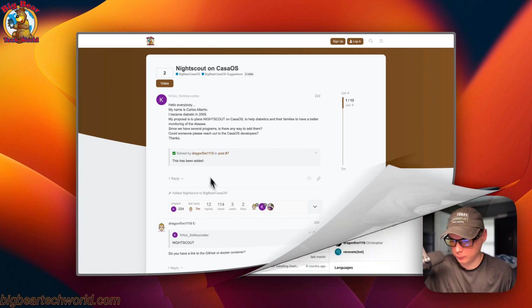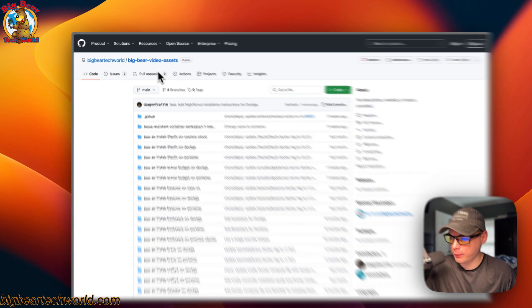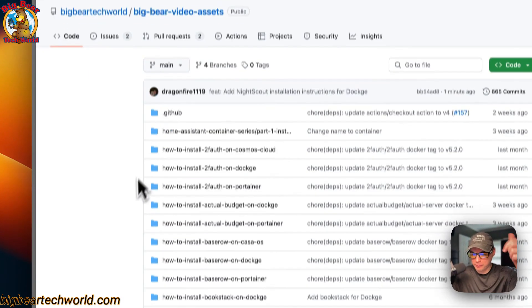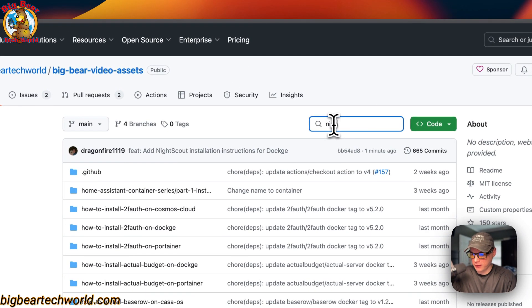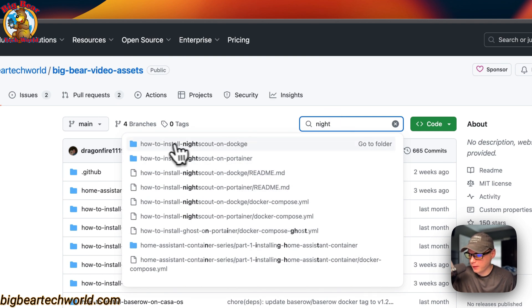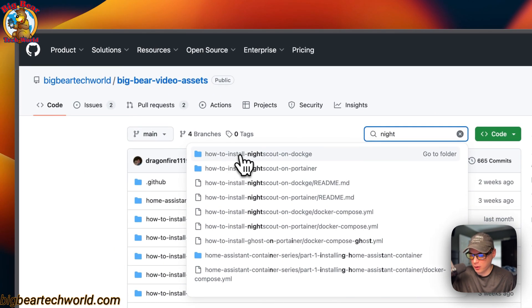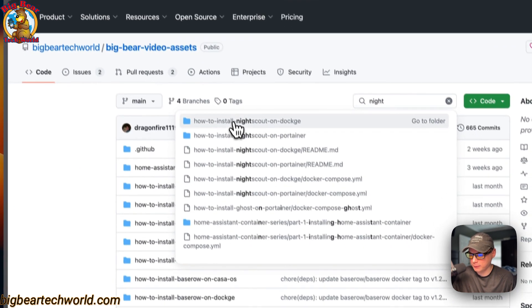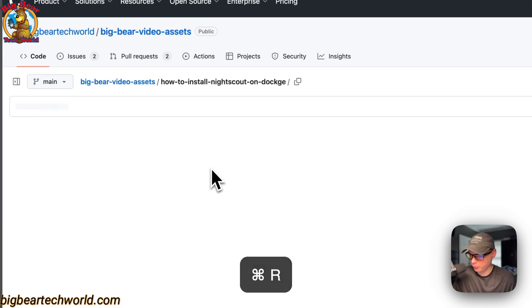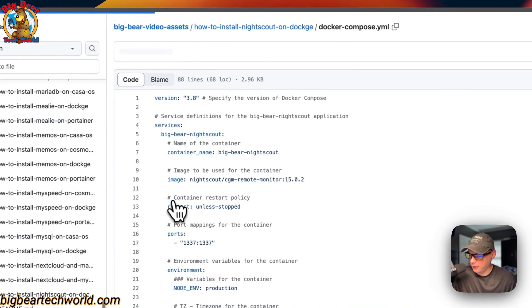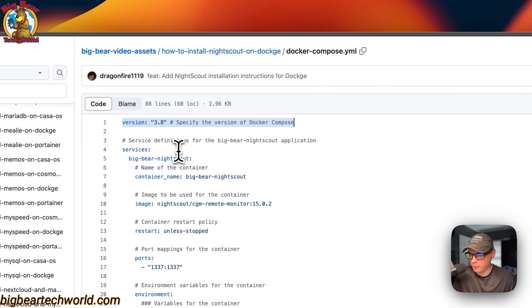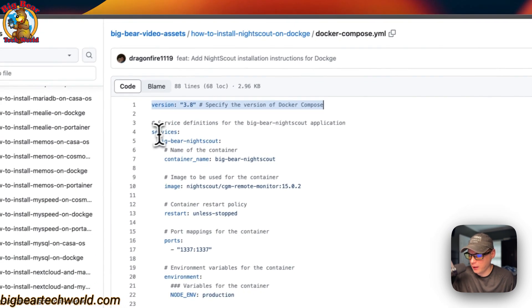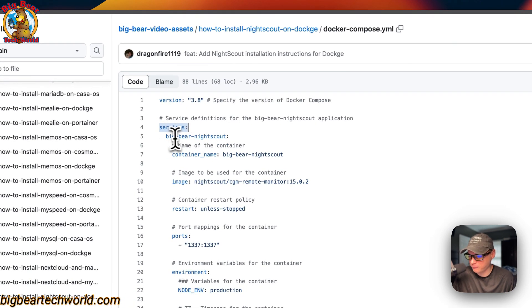Let's get started. I'm on Big Bear Video Assets — there will be a link in the YouTube description to get here. I'm going to the search and typing 'night,' and now you can see 'How to install Nightscout on Dockge' right here. I'm going to go to the Docker Compose file — version 3.8 of the Docker Compose file format is being used, and I'm setting up some services.